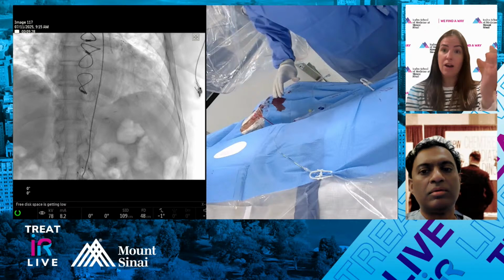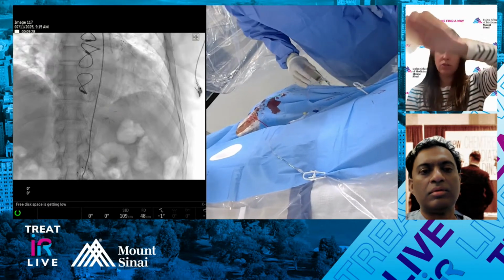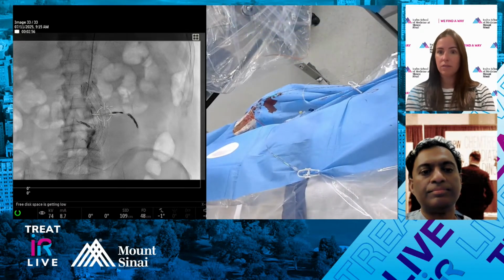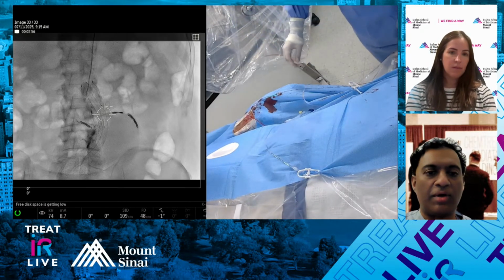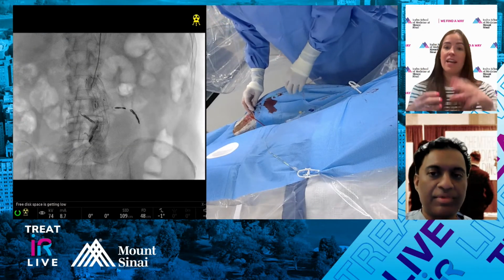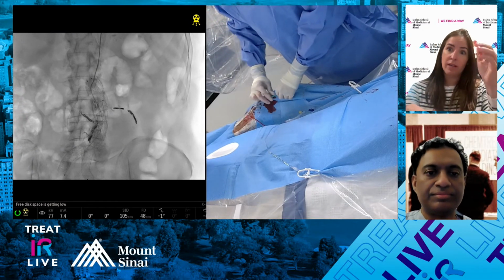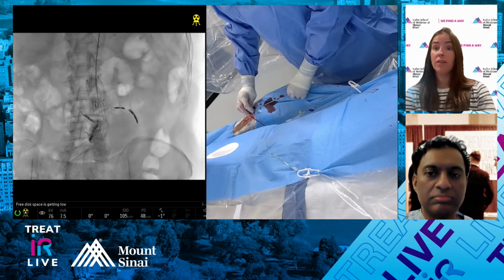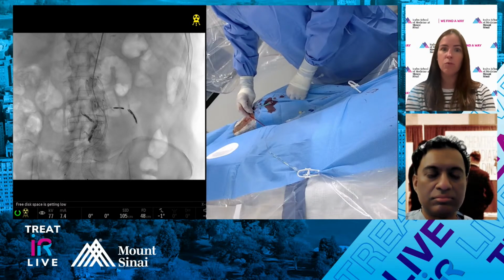You can kind of take it, downform it, and then it'll hook. If there's a lot of tortuosity, it hooks the descending. It's a nice trick to know. You form the Sim 1 in the ascending slash arch, and then once you're coming up the arch, you reverse the curve. Sarah actually hooks on the descending, and it works really nicely.